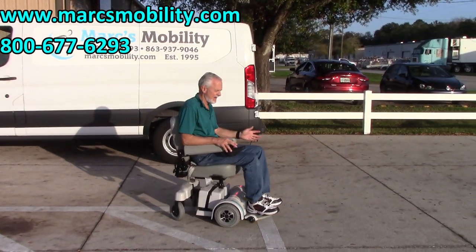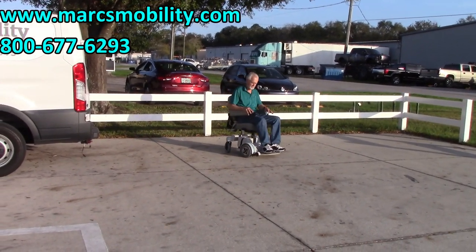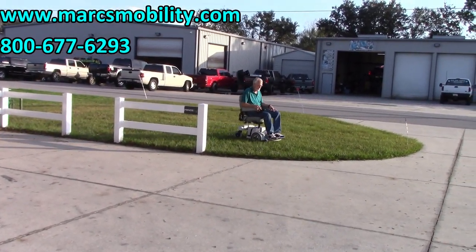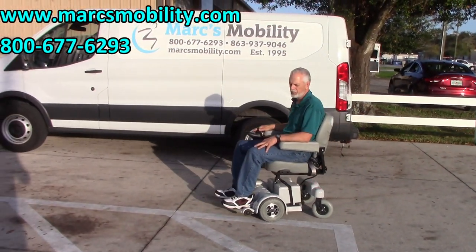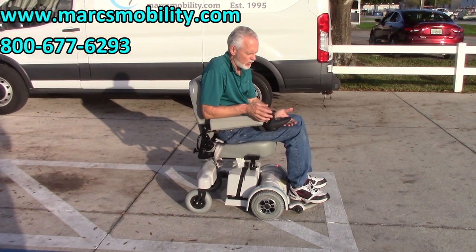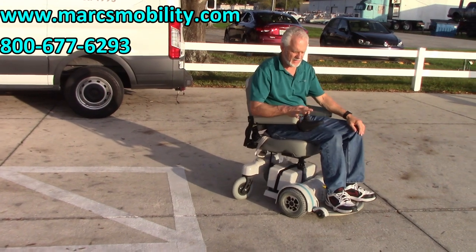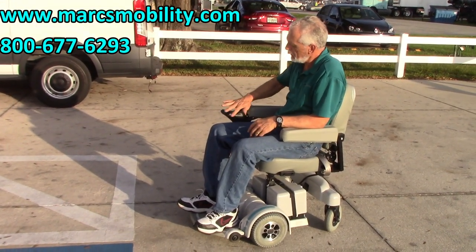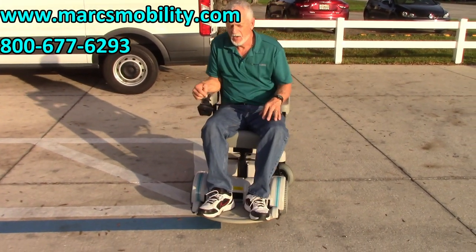This is such an easy chair to drive — so easy. The top speed is between four and five miles an hour. If I put it on speed number one — I was on speed five there — this is speed one now. You can't get in trouble at this speed. So if you have someone who's a little skittish, this is a real easy chair to learn to drive. Even if you're in a home and move your hand around, the chair is not going to respond immediately; it takes a second or two to start going forward, and same thing when you turn. So it's a really easy chair to drive.